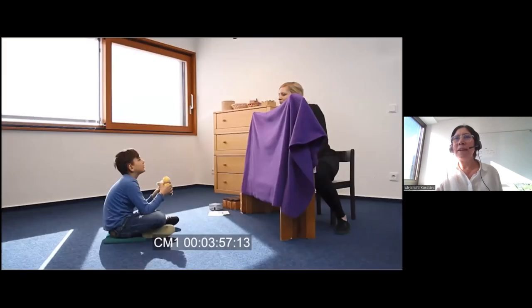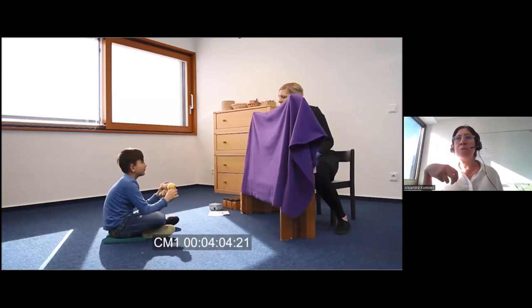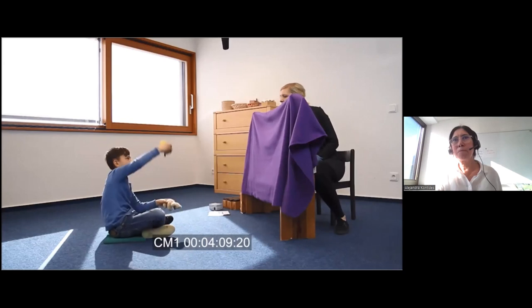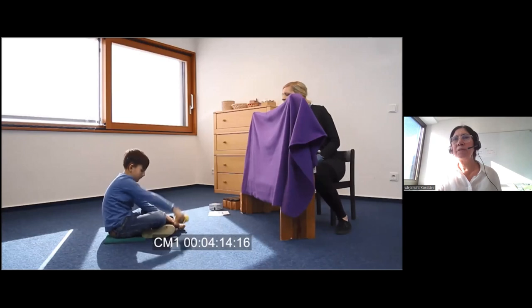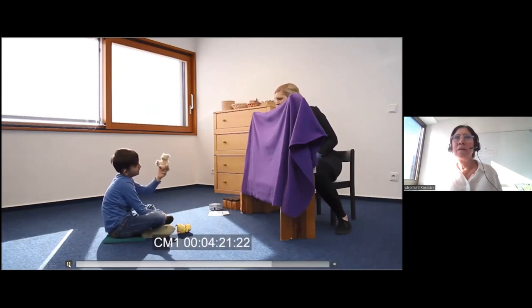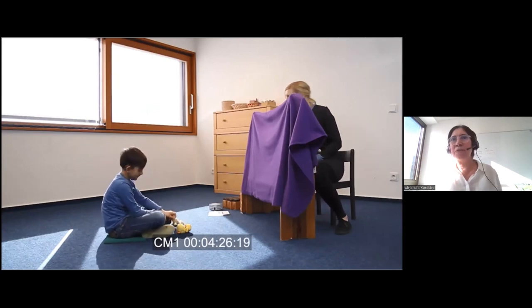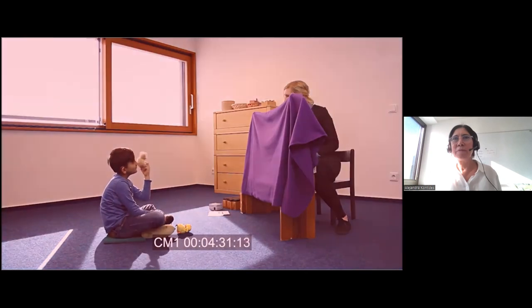Now he's going to do another exercise where these sounds are associated to the animals that he has in the hands. So he has to distinguish between high pitch and low pitch sounds. So this is the high pitch, it's like the bird sound. Again, the same. Low frequency that represents the bear. The same. Nochmal der Bär, super Leo.